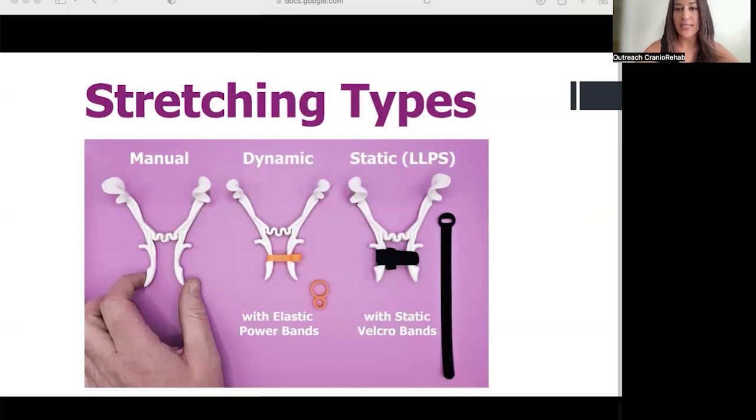When considering what type of stretching option to use, apply your clinical judgment by looking at 2 main factors. The first factor to consider is, what is being treated? Is it scarring from surgery, post-burn, fibrotic tissue from radiation? Secondly, how much time has passed since the initial incident? For example, if a patient had a facial burn, is it 3 weeks post-burn, 3 months, a year or more?